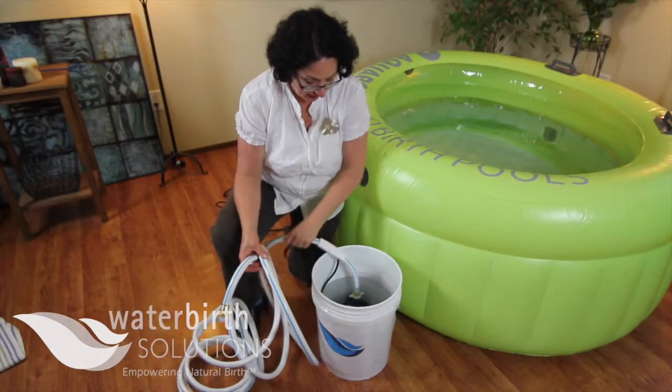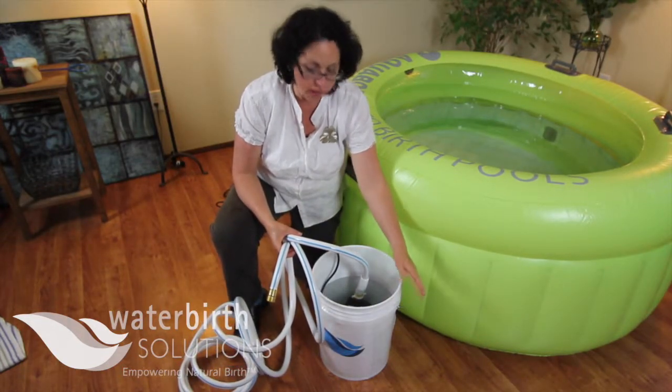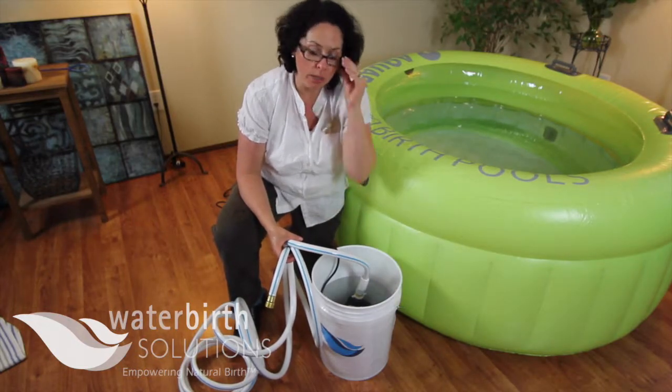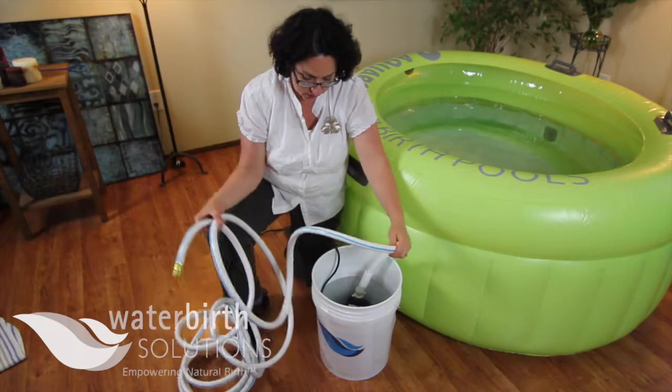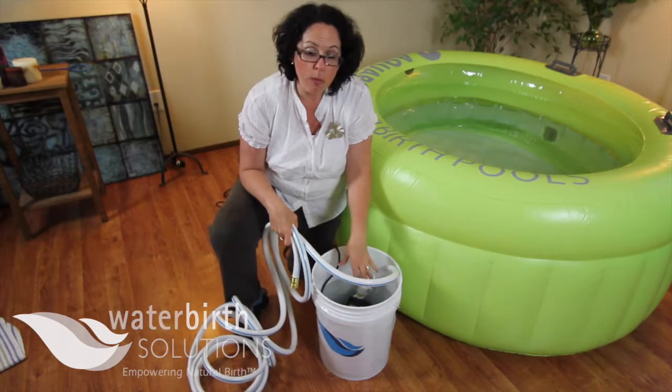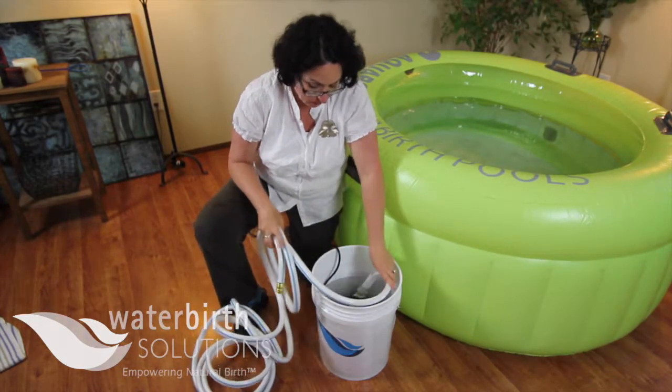Hi, we are back now. We have already drained roughly three to five gallons of clean water through our drain pump and discard hose. And now we're going to take the entire hose into a 1% bleach solution that we've placed back in the bucket.